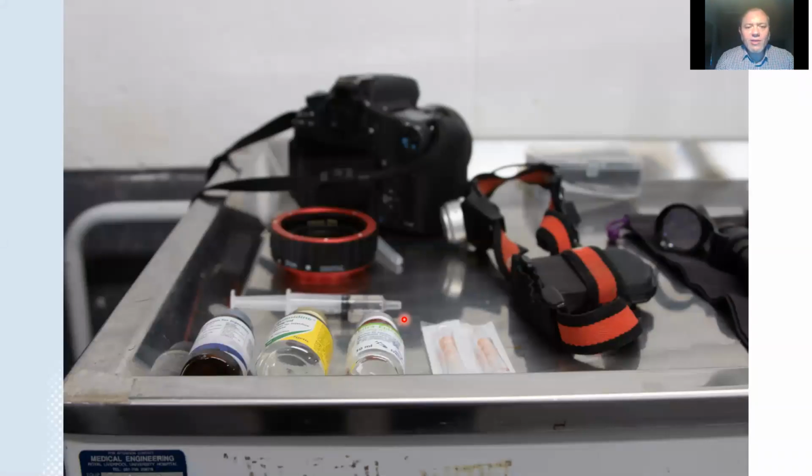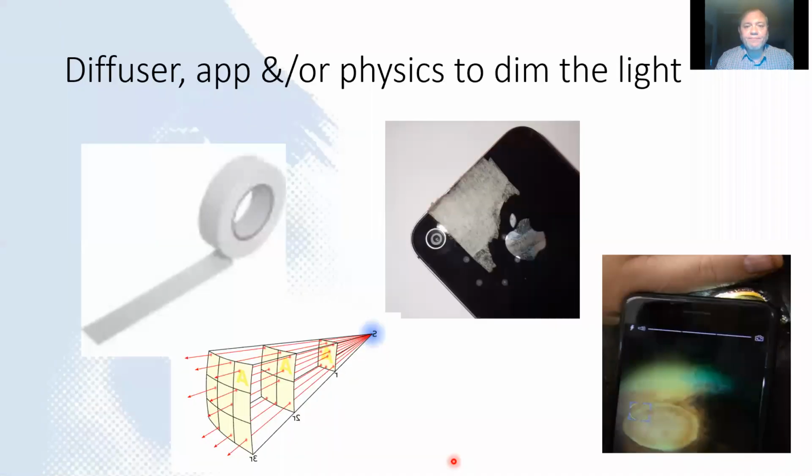So this is a horse who's awake, unblocked, and undilated, and we're obviously getting a glimpse of the retina past those lovely lashes. So sedation, nerve blocks, and dilation will be a routine part of all of our eye exams.